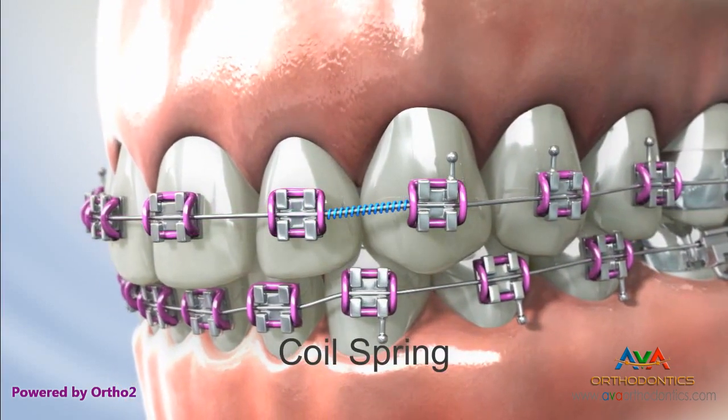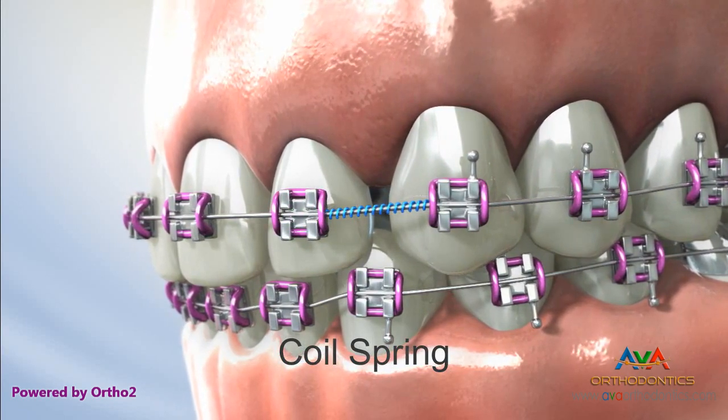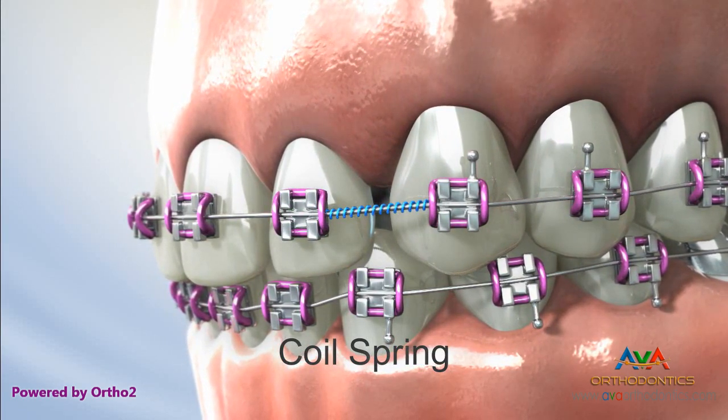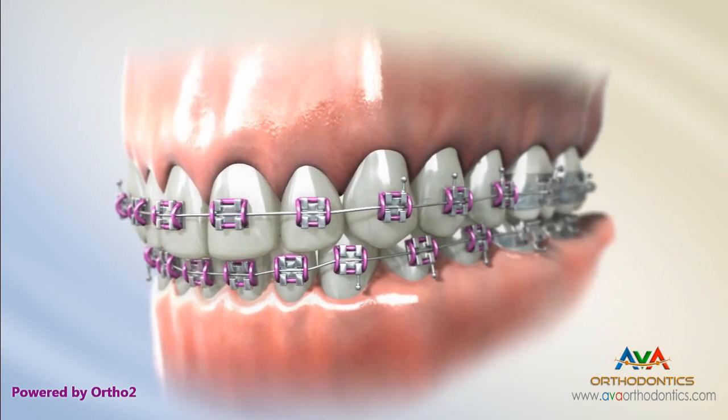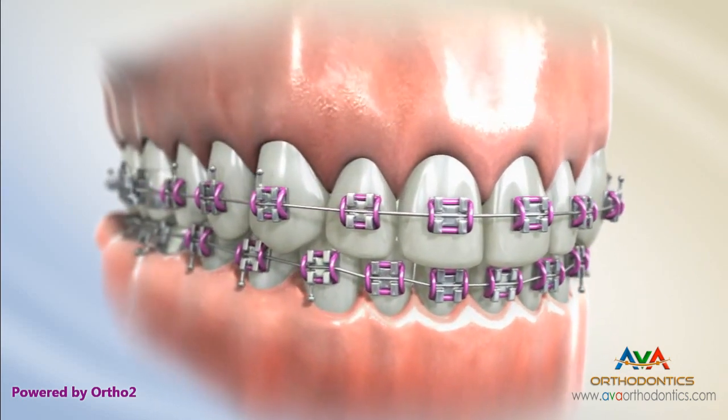A coil spring is often used to create space between teeth. This can be very important if a new tooth doesn't have room to grow into its proper place. Your orthodontist and staff welcome any questions you might have about braces and how teeth move.